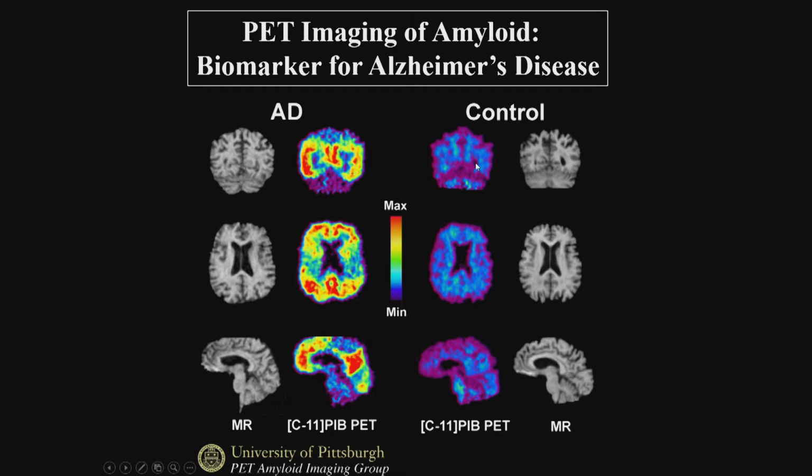Well, several different types of anti-amyloid therapy have been tested, like, for example, making antibodies to amyloid and seeing if the antibodies would remove amyloid and make the people better. In order to assess whether the antibodies are effective in removing amyloid, the patients are given serial images with this PET marker or a related one to the amyloid protein itself. So it can be used as a biomarker of drug efficacy, in this case of drugs used to treat or slow the progression of Alzheimer's disease. So far, there's no clear evidence that that's effective. But it's being looked at very actively.